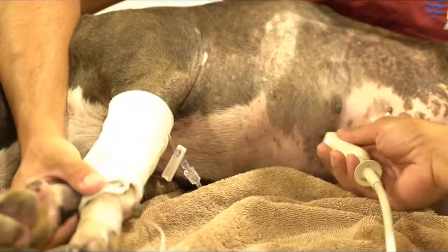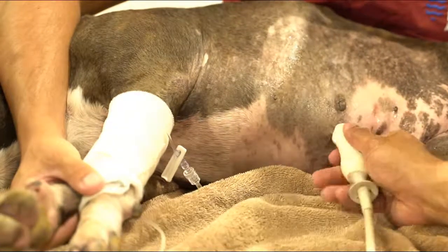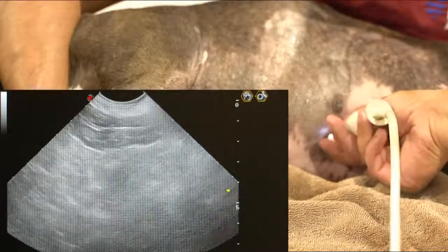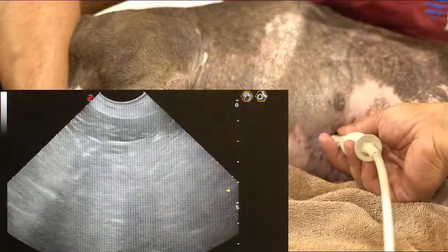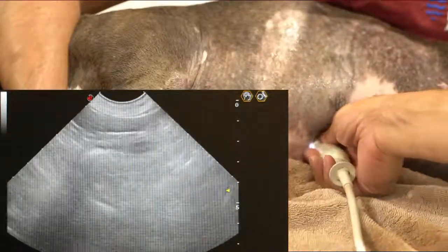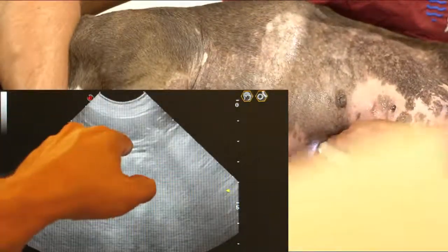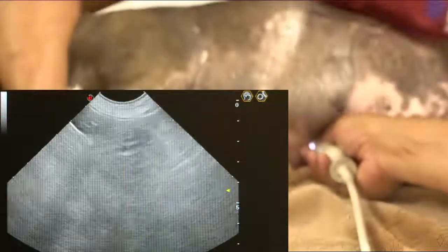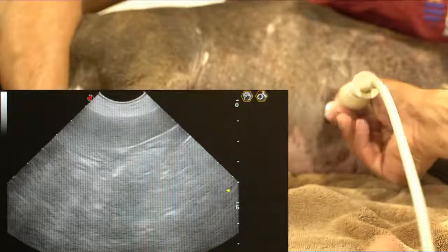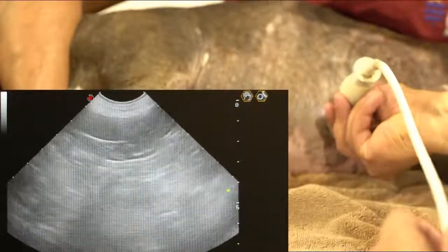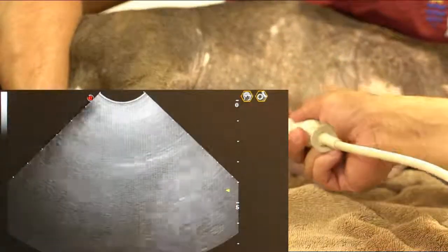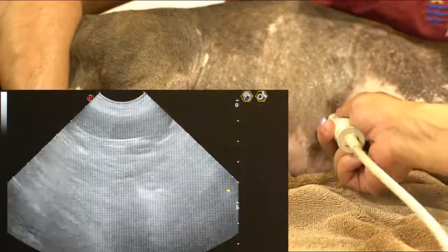The fifth view — a bonus view — is the umbilical view. Place the probe at the umbilicus and tilt down into the hepatorenal view, as fluid sometimes accumulates there. Be careful not to push too hard, as fluid moves away from the probe when you press in. There's no fluid in the dependent areas either. Final score: 0, 0, 0, 0, 0 — no free fluid detected.